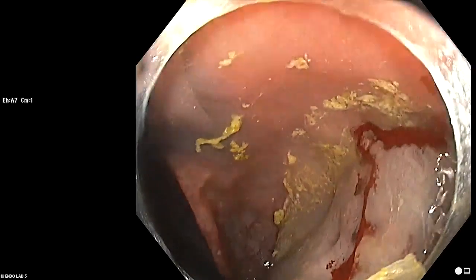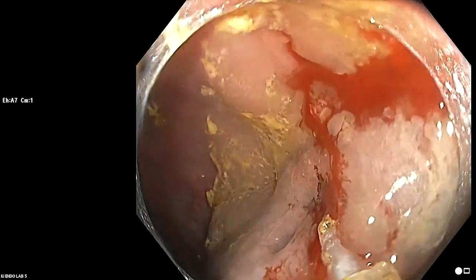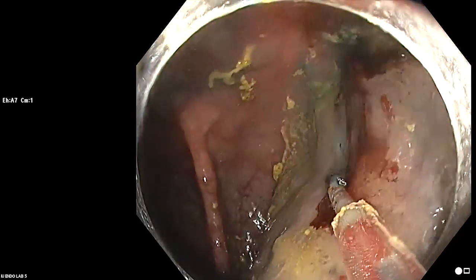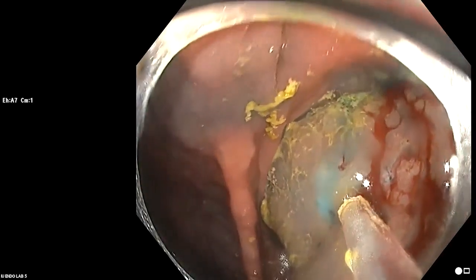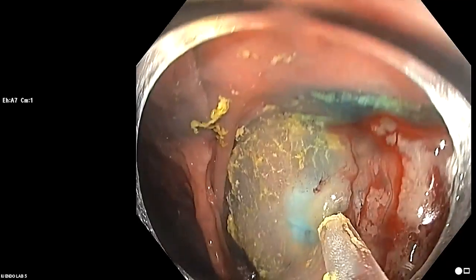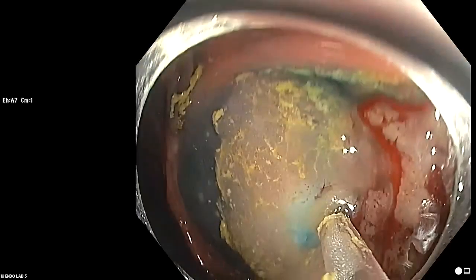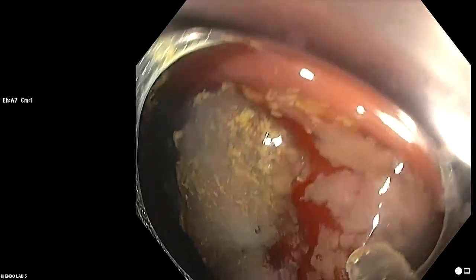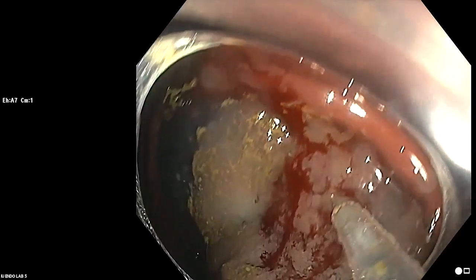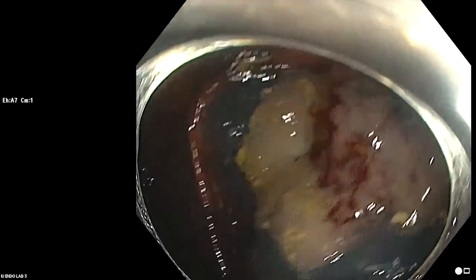So you can see how nicely, when you do needle in, inject, it delineates the border of the lesion. Inject, John. But whether or not we really need to do this, I think is an unsettled issue, and I'm a little bit biased that we probably don't even need to inject this. So I think it might be interesting for the panel to discuss whether people have converted to cold resection for the entire group of SSLs. Go ahead, stop, John. Or if you still feel that there's a segment of this group, based on size or the prevalence of dysplasia, that you need to use electrocautery. But I basically, regardless of the size, needle back. This is not a very big lesion. Let's go ahead and get the cap cold.